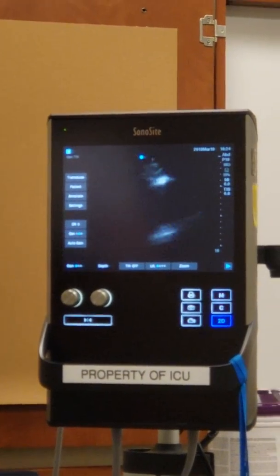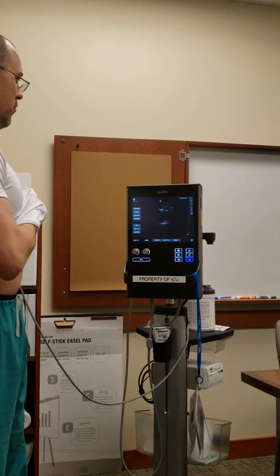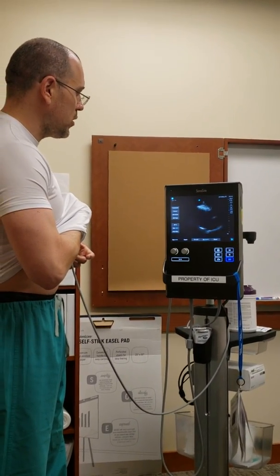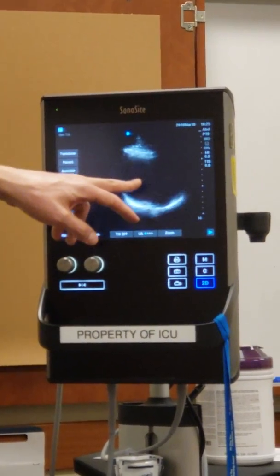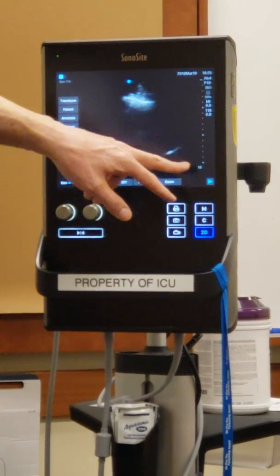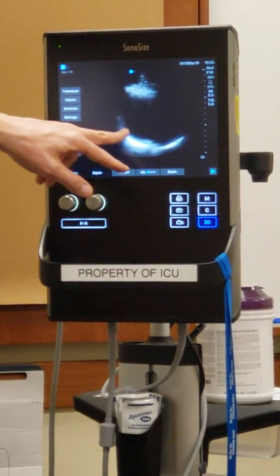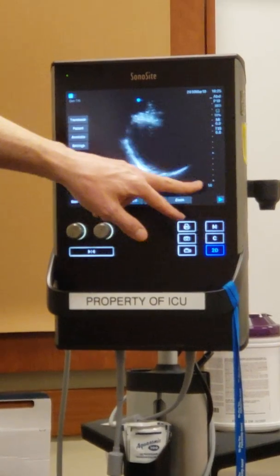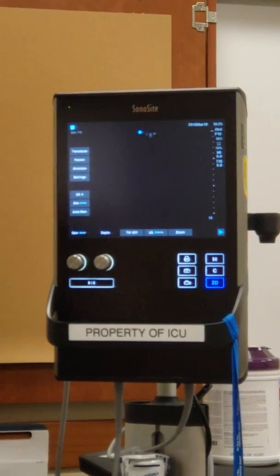That's a challenge to do on yourself — I'll have to cancel that attempt. But there's actually my heart right there. I can see it now, barely — not a great image, but you can see the right ventricle, left ventricle, and the septum. You can see that I want the depth at 16 centimeters; all the way in the back is my pericardium, and you wouldn't be able to see everything in this image without that depth.